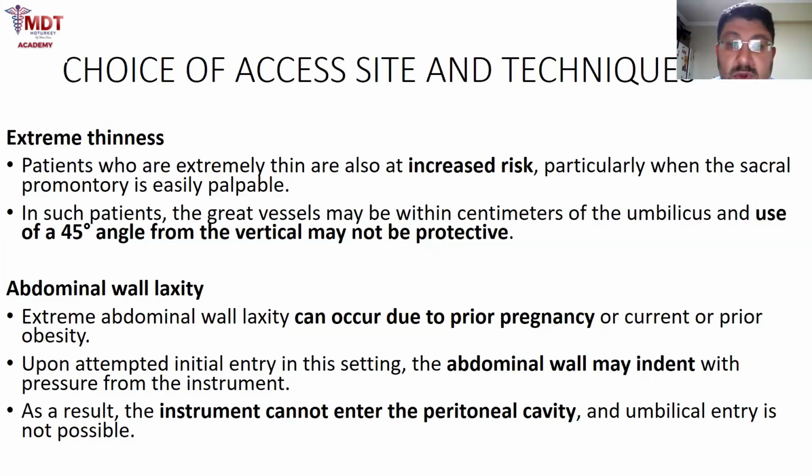Also, abdominal wall laxity may prevent peritoneum insufflation because it's hard to enter the peritoneal cavity if the abdominal wall is lax.